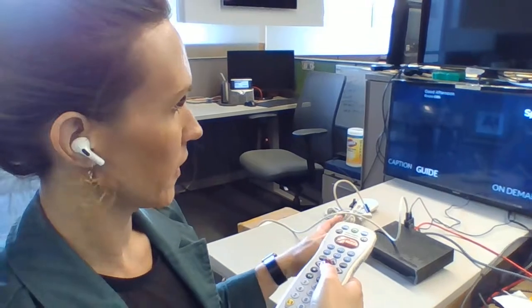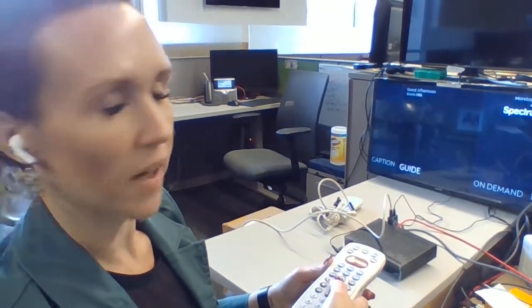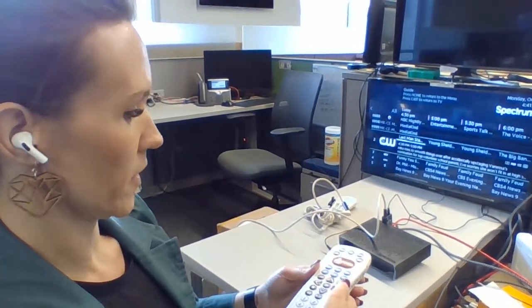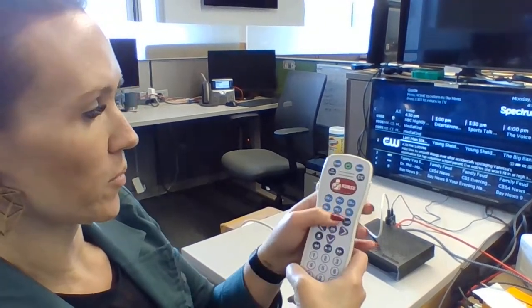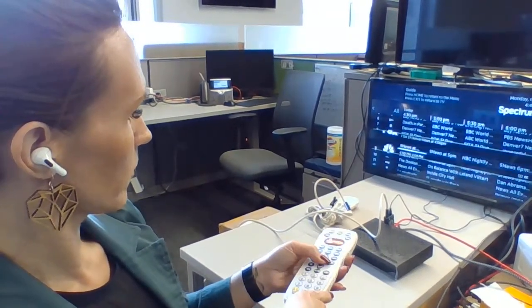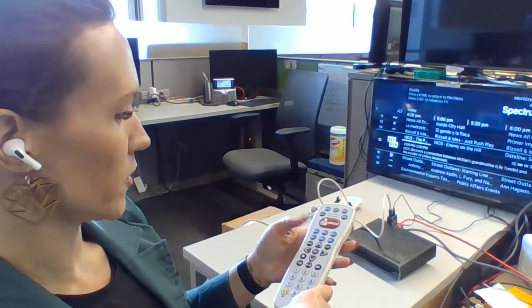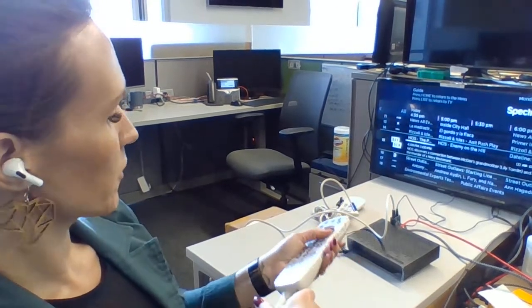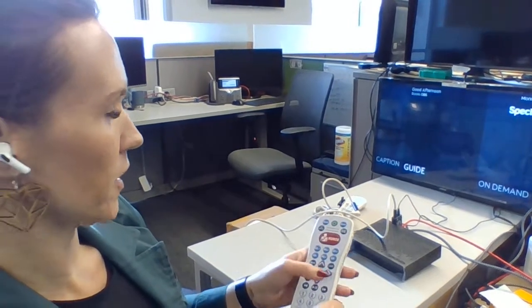This is our new interface that we are still working on. It has not hit production yet, but this is what it will be like. There's a guide where the customer is able to page up, page down. We're able to mute it from here — I'll press mute. So the response time is pretty quick.